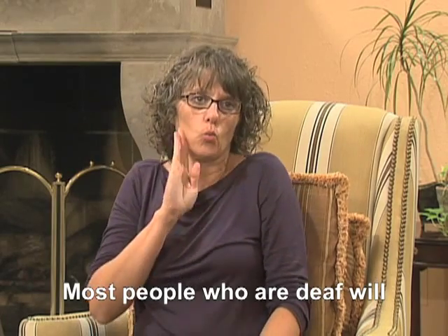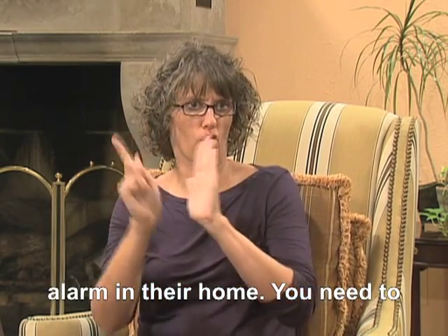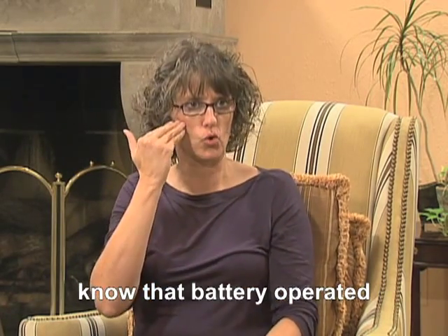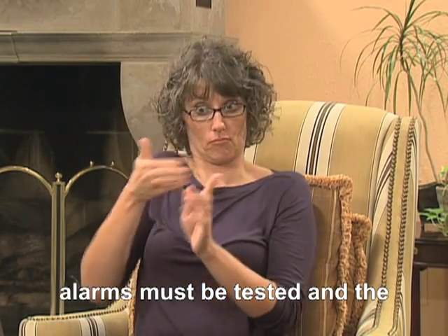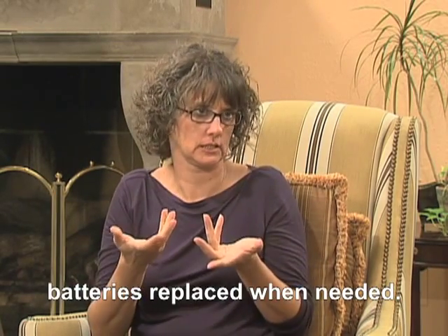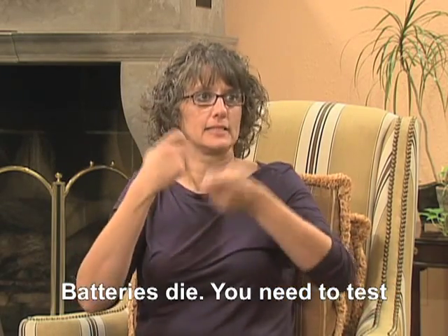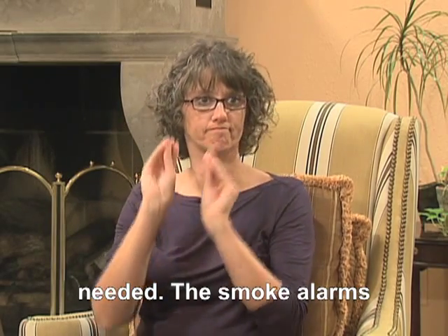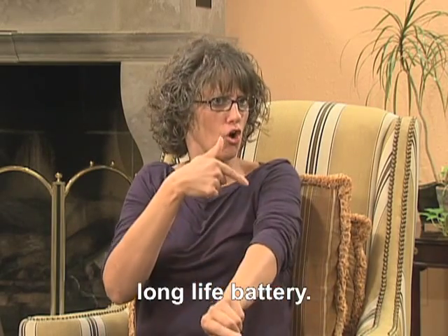Most people who are deaf will have more than one type of smoke alarm in their home. You need to know that battery operated alarms must be tested and the batteries replaced when needed. Batteries die — you need to test them and replace them when needed. The smoke alarms installed in Oklahoma have a long life battery.